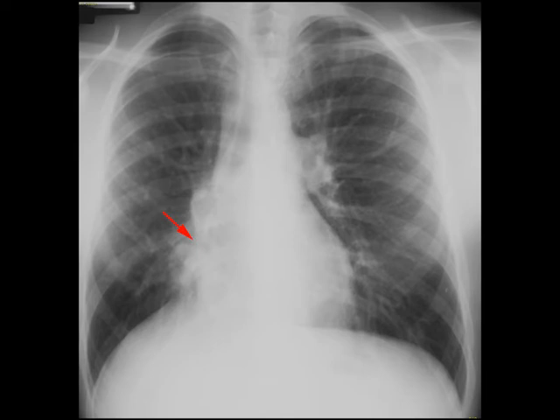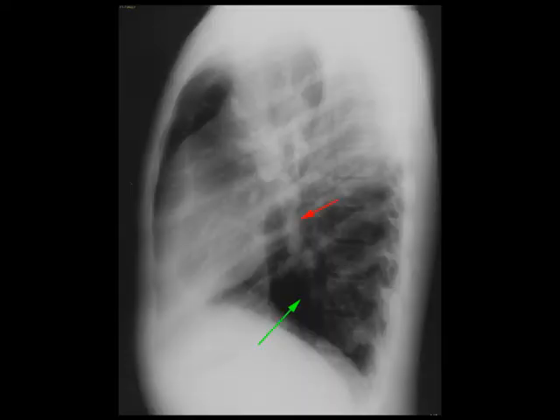Additionally, the red arrow points to a vertically oriented tubular structure. On the lateral radiograph, this tubular structure is again identified by the red arrow. The green arrow corresponds to a hyperlucent left lower lobe secondary to compensatory hyperinflation. Findings are consistent with scimitar syndrome.